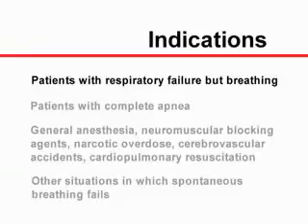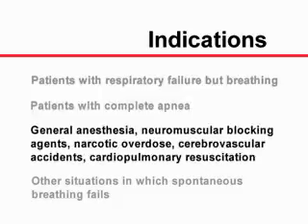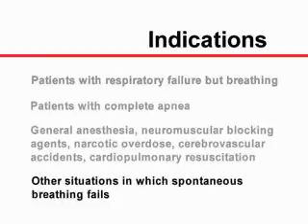Face mask ventilation is used in patients with respiratory failure who are still spontaneously breathing and patients with complete apnea. Face mask ventilation can be indicated after the induction of general anesthesia, the administration of neuromuscular blocking agents, narcotic overdose, cerebrovascular accidents, cardiopulmonary resuscitation, and other situations in which spontaneous breathing is failing or completely ceases.